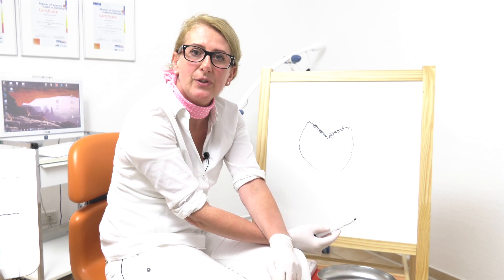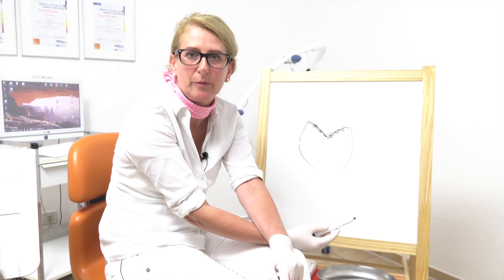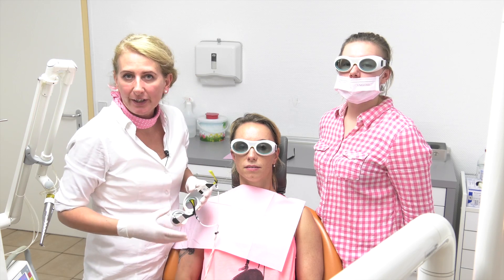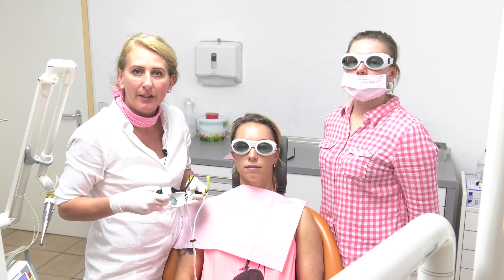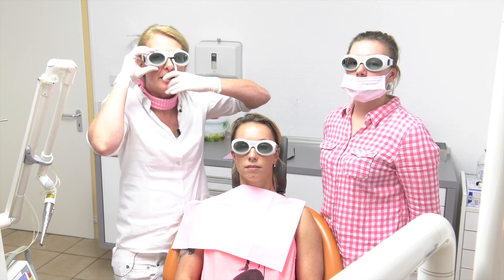Today we use the laser, and I think we should start showing the treatment. You couldn't see it, but we already cleaned the tooth's surface. Of course everybody has to use the laser safety glasses, including our cameraman.